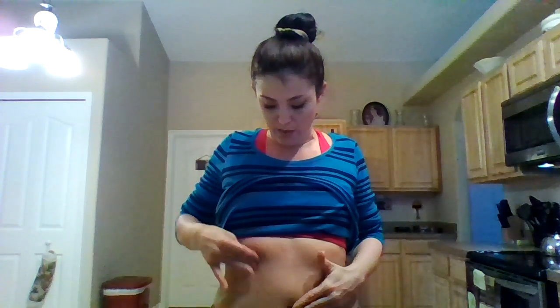So I'm going to put it on this side of my stomach. I'm kind of limited. It's only FDA approved to be on your stomach. I know other people use it on arms and legs, and that may be something I do in the future, but for right now, it's FDA approved for your belly area, and the clothes that I tend to wear most often leave me a little limited to the upper abdomen area. So I'm going to do it on this side today because this is where my old one came from. So just clean her off a little.